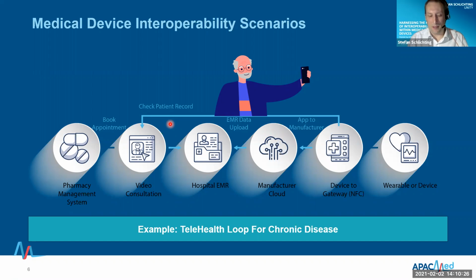And we think that is a perfect example where data is exchanged, where the data has to be meaningfully interpreted, in this case, for example, by the hospital, and where interoperability standards or technology will really yield a benefit, because then you can attach any kind of sensor, include it into the EMR, connect it with the rest of the data about the patient, and have a full picture of where he currently stands in managing his diabetes and what might be the next actions. For example, during diabetes management, he might need a lab test for his current glucose level. And we also describe in this scenario that this might be automatically booked through other systems or with the help of the nurse.